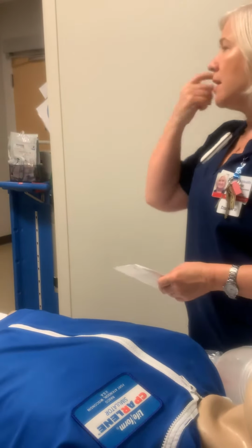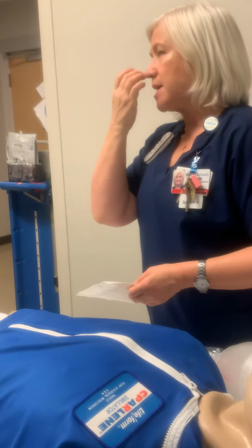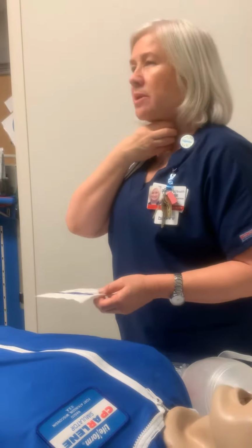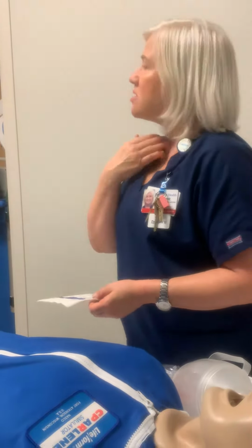It's sometimes just preference. If it's a real fresh trach, and we deal with those over here at Gateway, the tendency is they want to close up. But after they've been established 7-10 days, and you're starting to build up scar and it's going to stay open longer, you can ventilate either way. But if it's a real fresh trach, which isn't what you all are dealing with over here, this stoma is pretty well established, so you can certainly use that if they are swollen up here, which is sometimes the case with oral cancers and things like that.